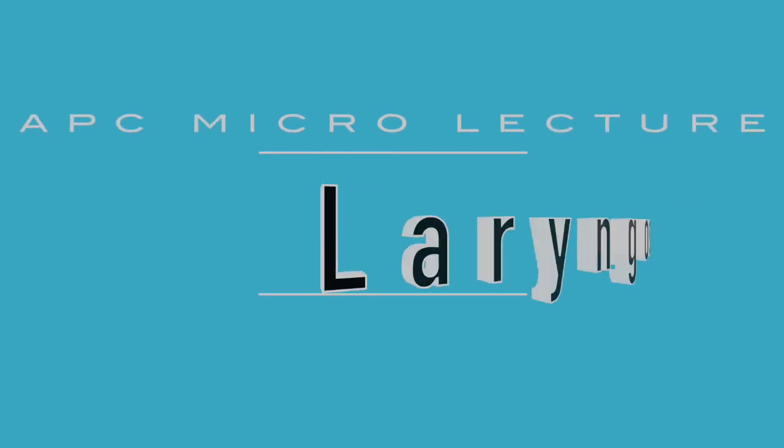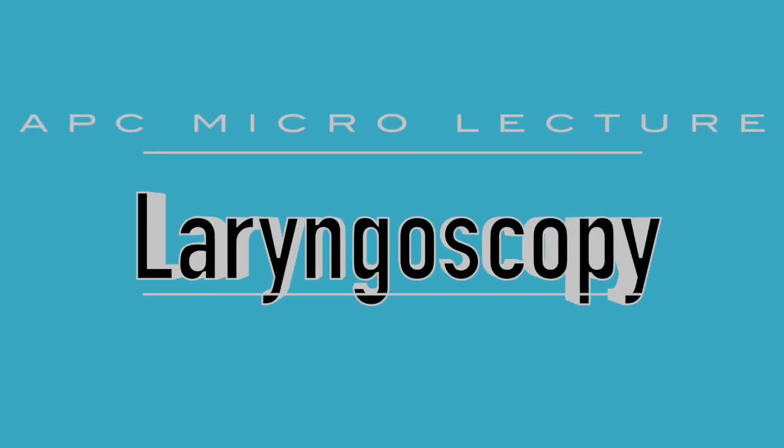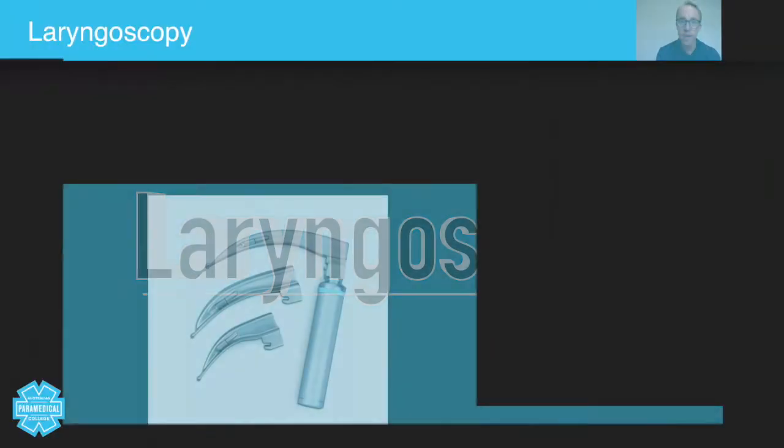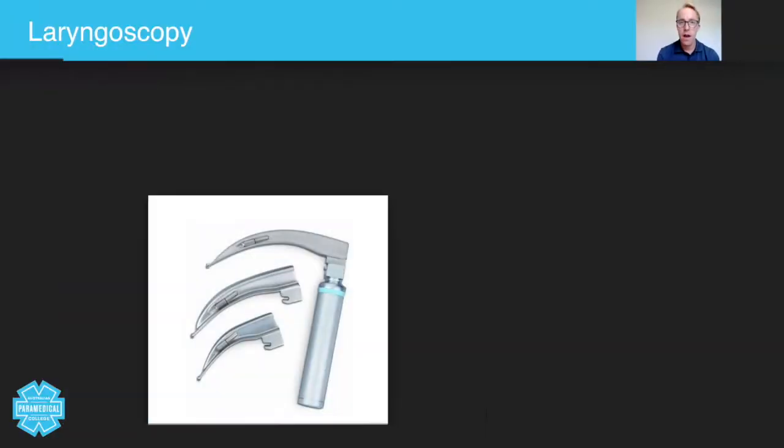Hey guys, today we are going to talk about the use of laryngoscopy and McGill's forceps to clear an upper or lower airway obstruction.